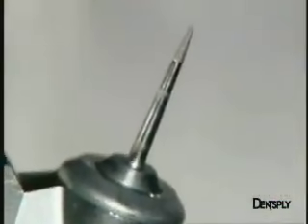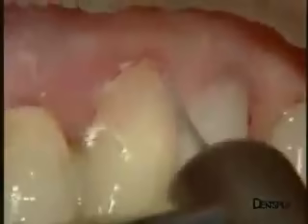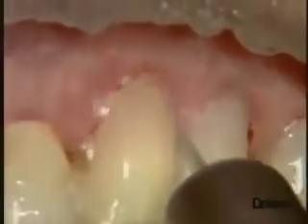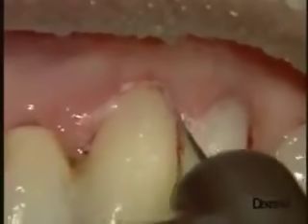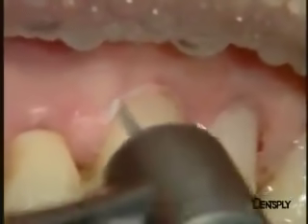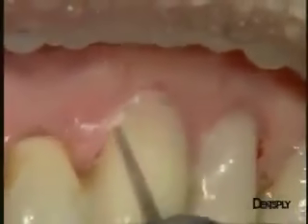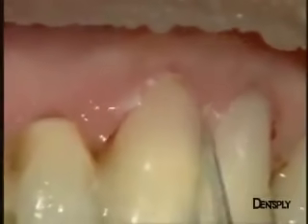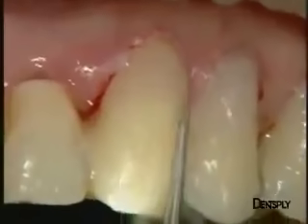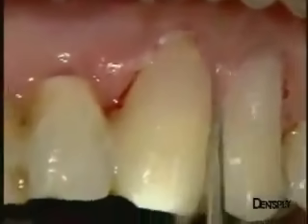We use a red ring gingival finishing burr for the finishing, especially for the cervical area, to obtain a perfect transition between the dental surface and the filling. In this type of filling, it is important to use a burr mounted on a red ring contra-angle handpiece in order to have better control of the instrument when we use it under the soft tissue. The use of a turbine here would not give us enough precision because of the speed and the weak pressure exerted on the instrument. In the same way, we eliminate the excess but still preserve the lobular convexity on this canine.